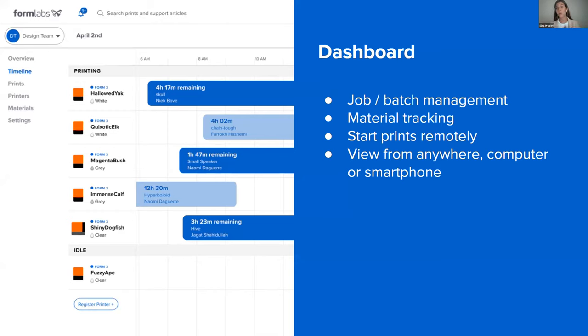And also it's very important to bear in mind, you also need to get your staff on board. So you also need to know how you will arrange your overall printing time and practice management in order to see how you will delegate the tasks, who will do what, and if your dental assistant is going to do some washing or curing. So you know exactly what you are doing and at what time. So this is a very useful tool for that purpose.